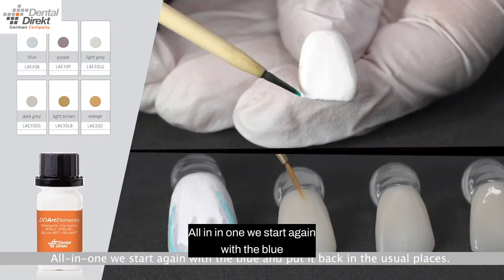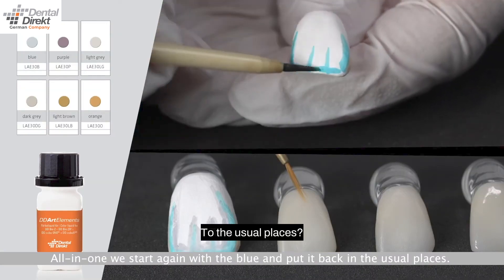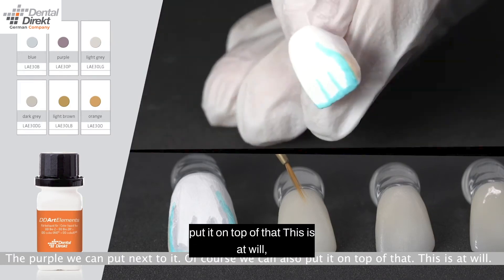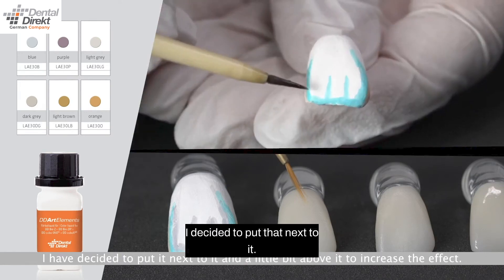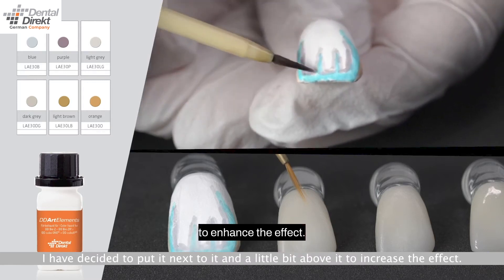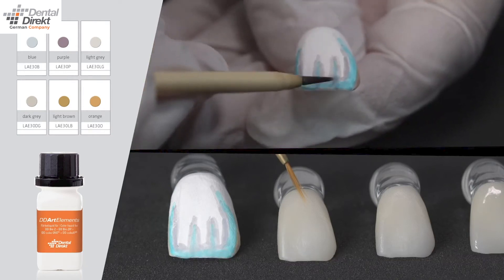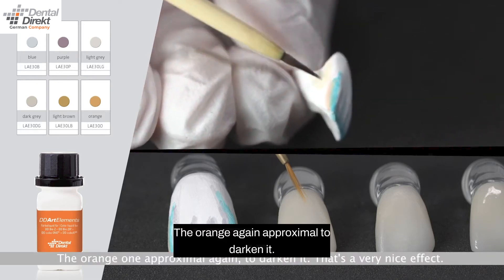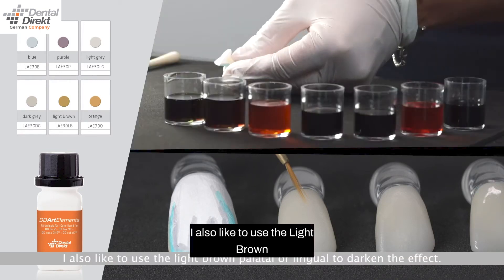All in one, we start again with the blue, placing it in the usual areas. The purple we can place next to it or on top — this is at will. I decided to put it next to it and a little bit above to enhance the effect. The orange again proximal to darken — a very nice effect. I also like to use the light brown.